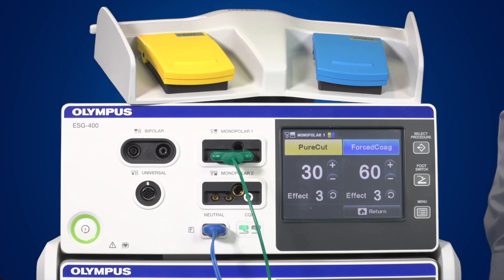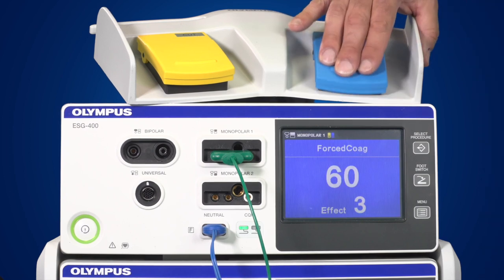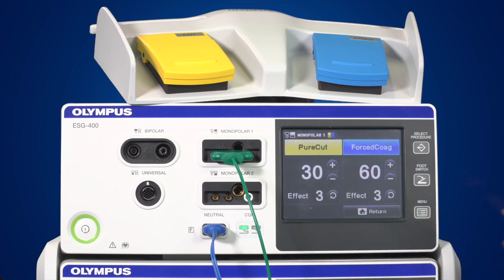Instruments can be activated in two ways: either by using a foot switch or a hand switch. The foot switch supplied with the generator has a yellow cut and a blue coagulation pedal. A separate foot switch with a single blue coagulation pedal can also be purchased — this is used for coagulation only. In order to avoid confusion, you can only connect one single and one double foot switch to the generator.